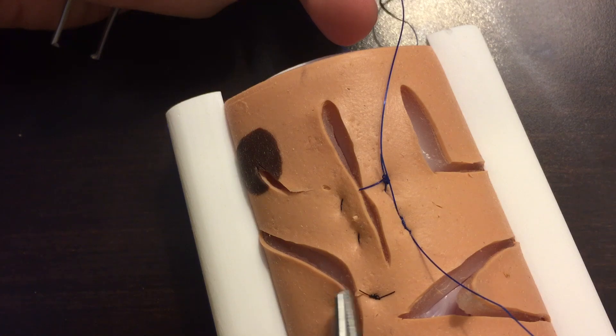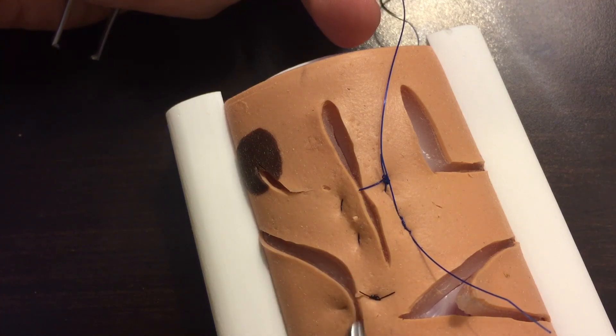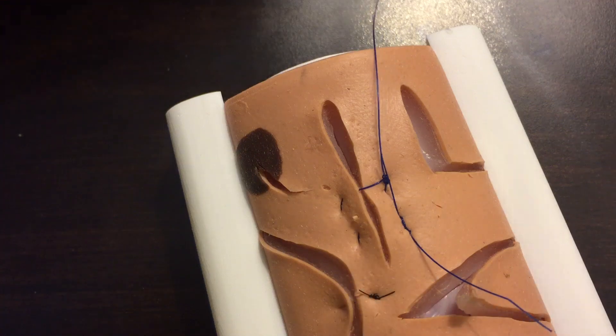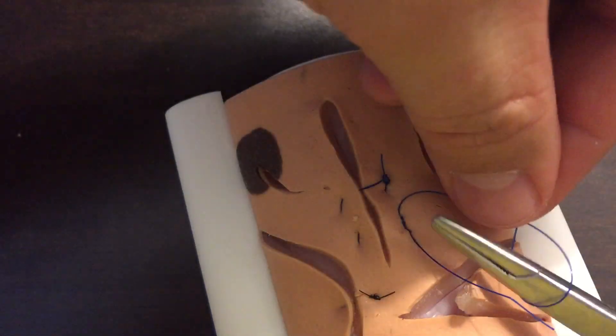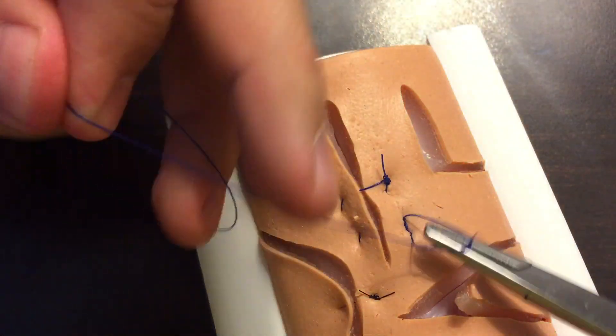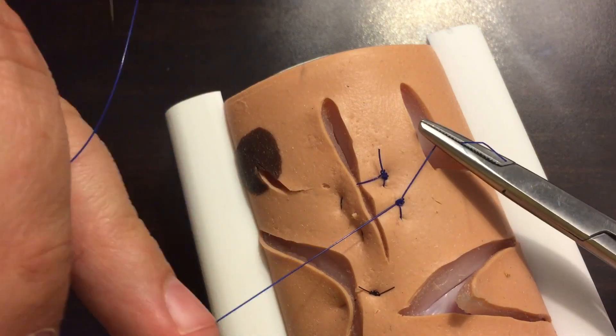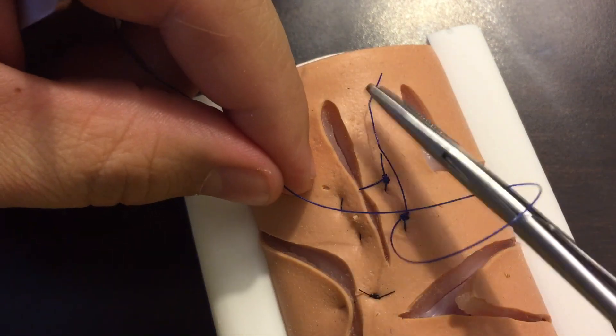I'll pull this skin flap over, hold it in place with a horizontal mattress while I suture the rest of it, and then I usually pull that horizontal mattress suture out because I don't want to worry about any strangulation of the skin. But it is a very useful suture technique and something that we definitely want to know to have in our toolbag of skills.